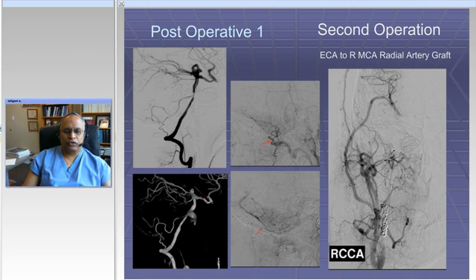now just 1, through the basilar, through the PCOM is supplying the carotid on the right side. But this has already formed an aneurysm. You can see that right here.